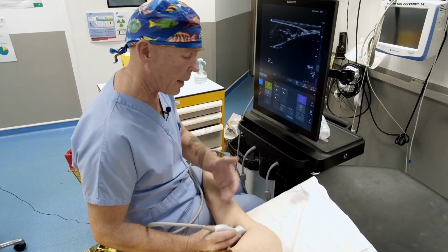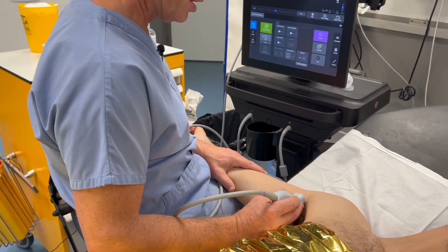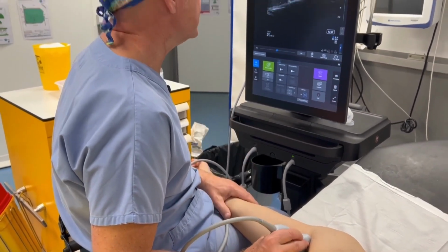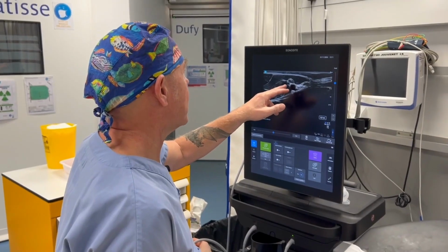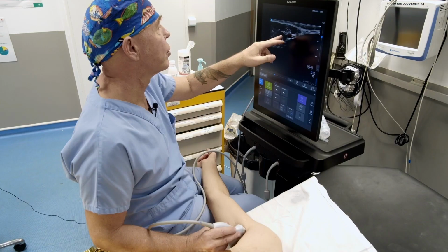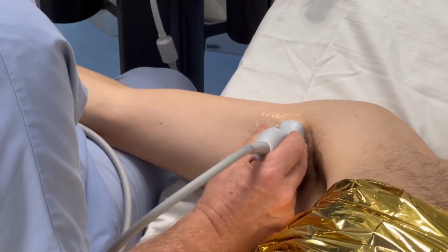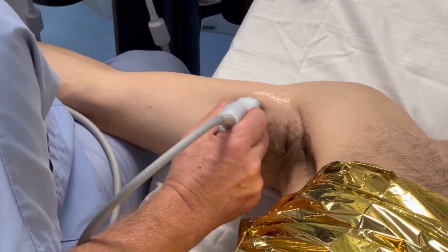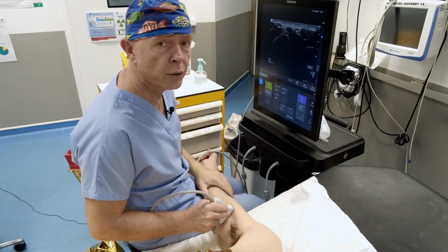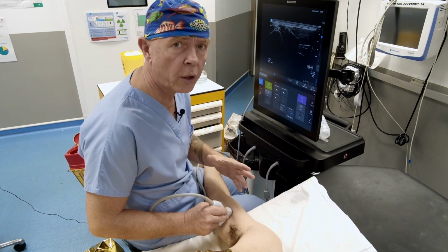So workshop number 4: do it on a volunteer, and spend about 15 minutes on each nerve, practicing identifying the elements we've seen and memorized. You follow the nerve bundles dynamically to make sure they are the intended anatomical structures. There is no need for neurostimulation. The median nerve is clearly visible in this position, and if we keep following it dynamically, it will curve around the artery. So that concludes the procedure for the ultrasound-guided axillary brachial plexus block.